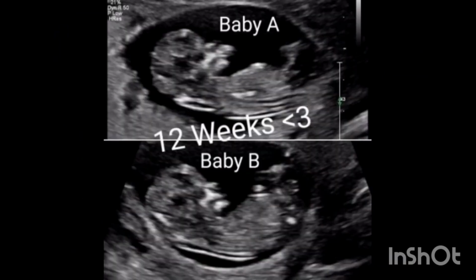The crown rump length of the fetuses, in a case of multiple gestation, is the most important ultrasound parameter for dating of the pregnancy and, if necessary, to correct the gestational age in cases with a non-reliable menstrual history. The onset of early growth retardation in one of the fetuses may indicate a higher risk for chromosomal abnormalities.